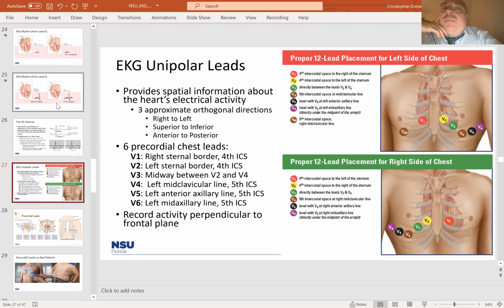Okay, so once again, we're not there yet, but something that I'll just throw out there, if you want to just put it in your brain for now, is that anytime in the inferior leads you have suspicion of an MI, you always want to go and check the right side of the heart with a right-sided EKG, and bare minimum V4R, or a right-sided EKG.